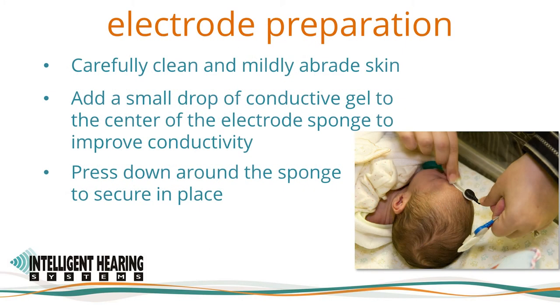Make sure the skin is clean. Skin that is too dry, too oily, or flaky may affect impedance. Prepare the skin with NuPrep or an electrode prep pad, carefully cleaning and mildly abrading the skin using small circles at electrode locations. To obtain the most ideal impedance — especially on delicate skin that cannot be abraded — IHS recommends the use of spectrogel in addition to the gel already on the electrode. Place a small drop of spectrogel on a gauze pad or on the backing of the electrode, and use a small dab in the center of the electrode sponge. When placing the electrode, press down around the sponge to secure it. Do not press in the center, as this can spread the gel and make the electrode come loose.